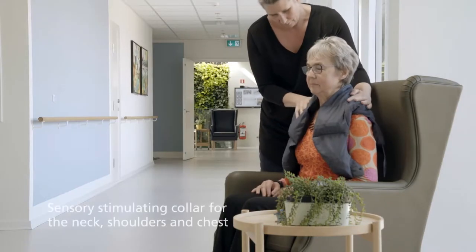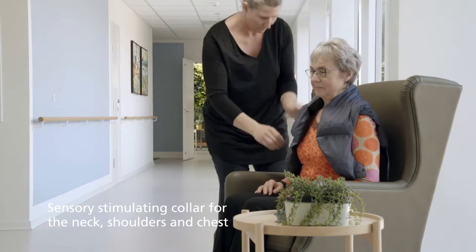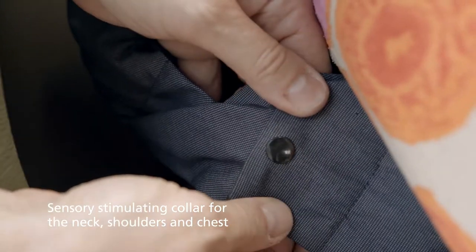ProTac Sense On is a sensory-stimulating collar, fitting naturally around the neck, shoulders and chest. The collar is filled with small beads and it is suitable for children, adults and elderly.